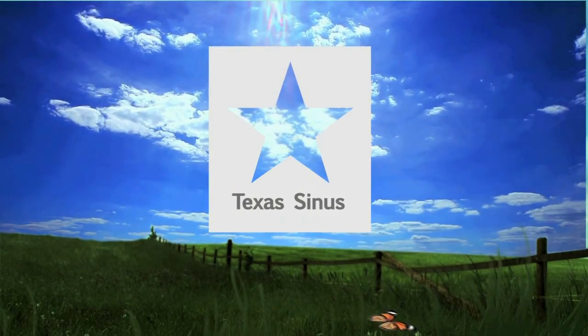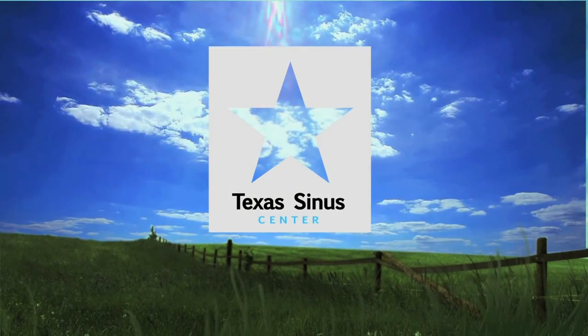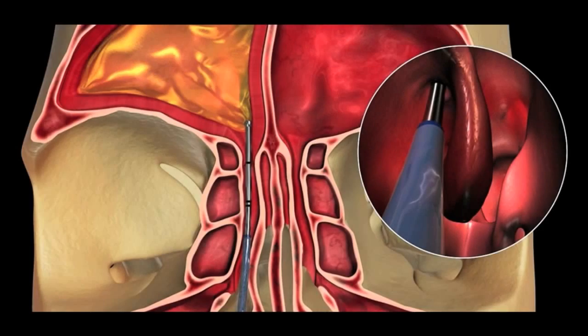Hi, this is Dr. Atkins of the Texas Sinus Center. In this video, I'm going to show you an animation of how we do balloon sinus dilation in the office.